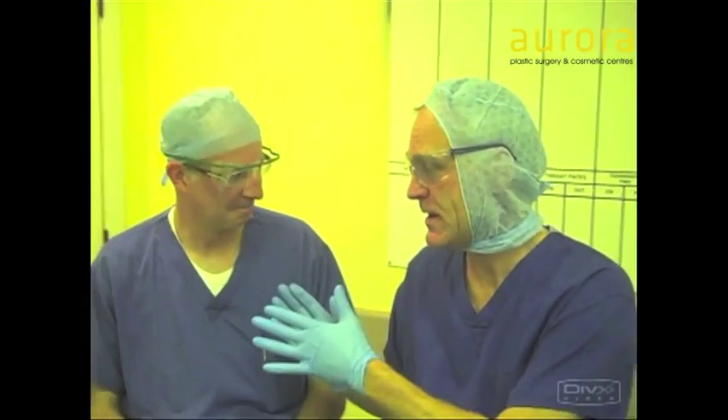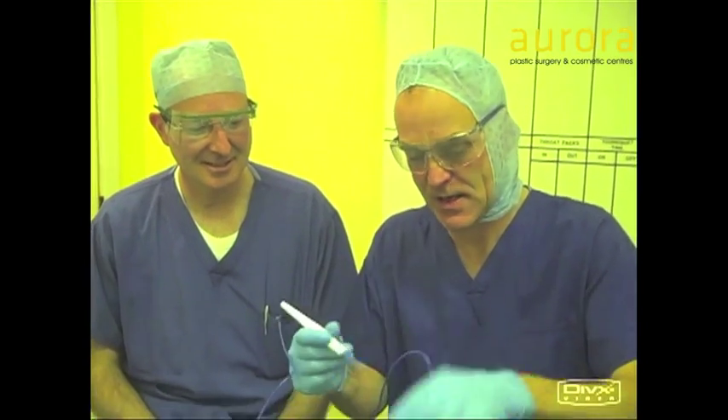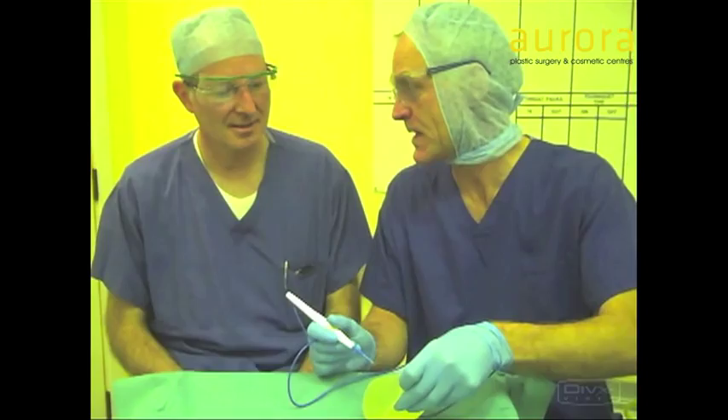So I'm here with Dave, who's my anaesthetist. Dave's very clever — he went to Oxford and Cambridge. And he pointed out that when I was diathermying the implant when it was in, I was making a mistake. And what mistake was I making, Dave?